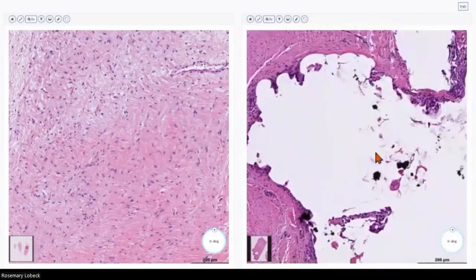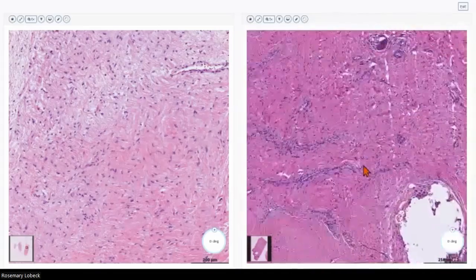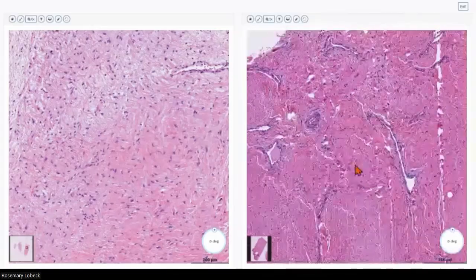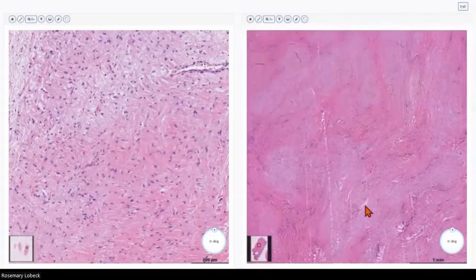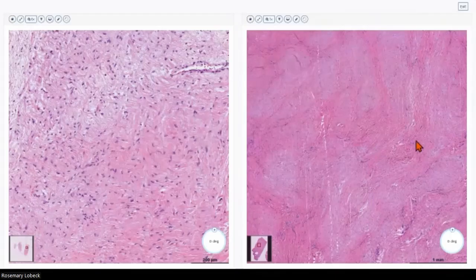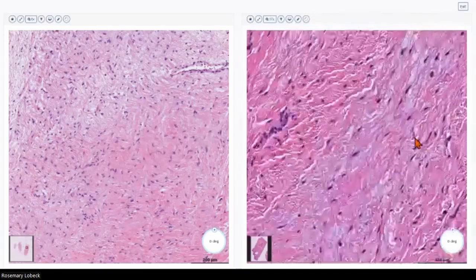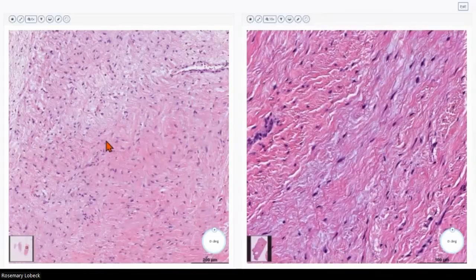If you polarize this, you will get all this material, which is basically the polyethylene that's polarizing. And then adjoining it, we also see more obvious evidence of giant cell reaction. You keep going, all this is a scar, scar, scar, everything is a scar, right? And then you get a big old scar here too. It's just that this scar also has some myxoid areas. So if you zoom in on any of the areas in this particular scar, you can see that there's hardly any difference between our low-grade fibromyxoid sarcoma and what is obviously a scar. So this is a huge pitfall, right?